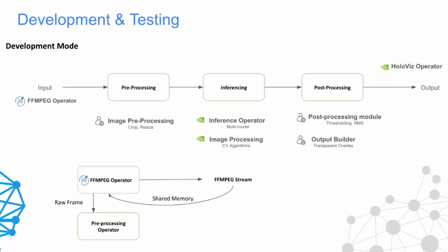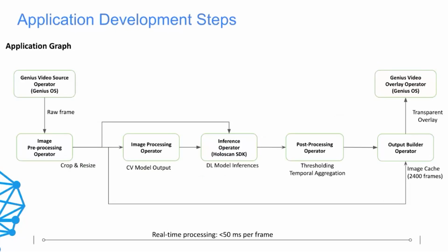Once we have designed all the operators, now we are going to define all the interactions between these operators, so the flow of the directed acyclic graph. Over here, the video Genius source operator provides the raw frame to the pre-processing operator. The processed image is then transmitted to the inference layer as well as the output builder for caching the image. These outputs then flow directly to the output builder, and then the transparent overlay is transmitted to the Genius video overlay operator. Overall, this graph needs to run within 50 milliseconds to meet the requirement of 20 frames per second.